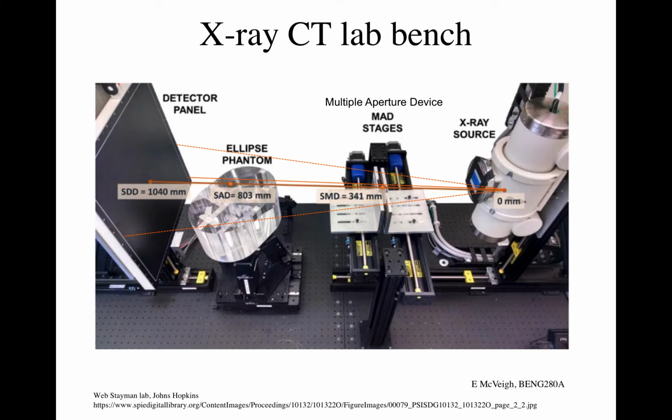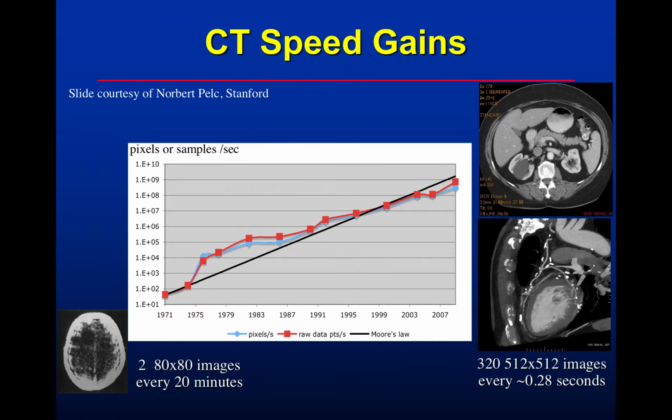When you're doing a contrast injection, or it's a patient who has been imaged before and is coming back for a follow-up image 2 weeks later, you should be able to actually image them with about a third of the irradiation that you got the first time. Because there's a lot of stuff, you know what it is and you don't care what it is. So why even illuminate it? You have to know what it is in order to reconstruct the image correctly, but you don't really have to know what it is in great detail. And so this modifies the X-ray beam to adjust for that. But that's not on modern scanners yet. It's all still in laboratories right now.